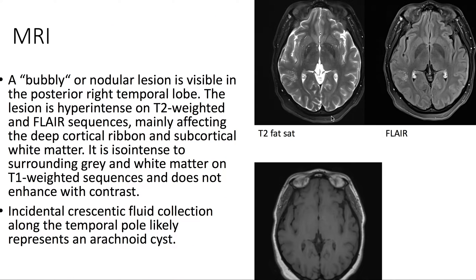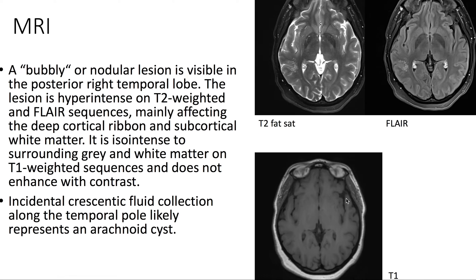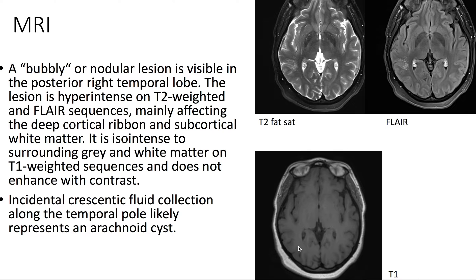On MRI, we see a bubbly or nodular lesion in the posterior right temporal lobe. The lesion is hyperintense on T2-weighted and FLAIR sequences. On T1-weighted imaging, the lesion appears isointense.